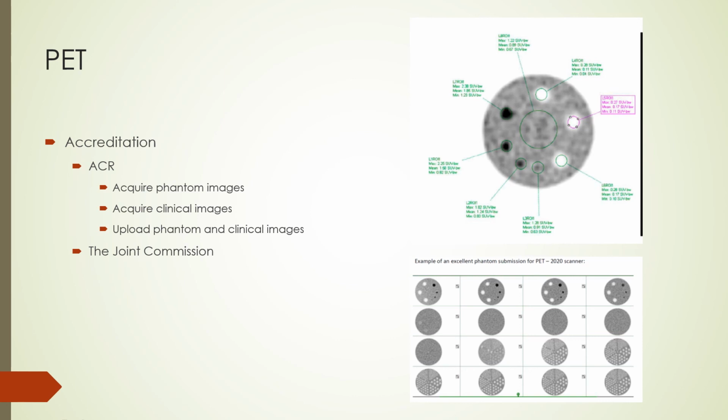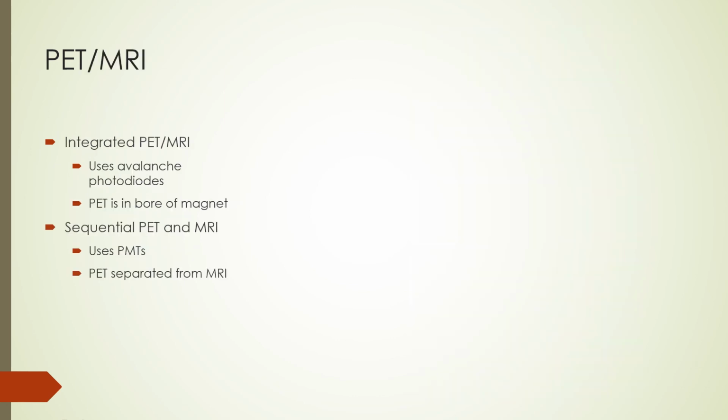As in PET-CT, when PET imaging is combined with MRI, the MRI system provides tomographic images with excellent depiction of anatomic detail, and the PET information is spatially co-registered with the MRI information. The MRI information is also used to estimate attenuation coefficients in each voxel of the patient for correction of the PET information for attenuation of the annihilation photons.